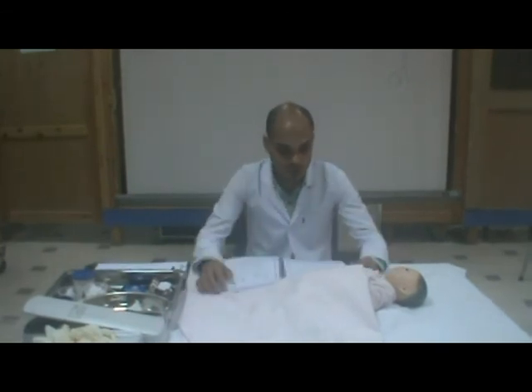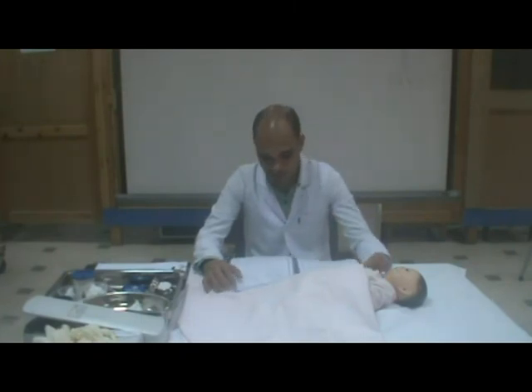Look at your procedure book for different arm circumference sizes and different cuff sizes according to different age groups. Look at your procedure book for a table of different formulas to determine the systolic and diastolic pressure according to the child's age. Look at your procedure book for sites of measuring blood pressure from upper and lower limbs.